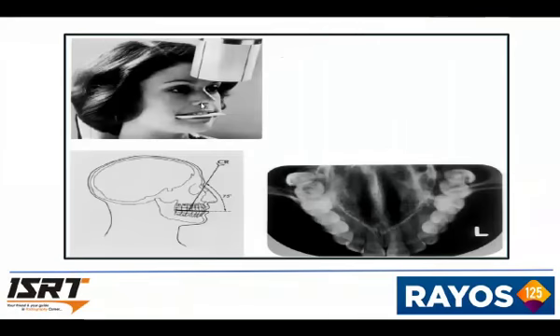So this is in the case of a mandibular occlusal. In the maxillary occlusal, we could see the whole of the palate in relation to the teeth. So that can be evaluated in the case of cysts and extension of the cyst, etc. So this is the case of a true occlusal. We need a dedicated X-ray film for the occlusal, and we are directing the beam caudad or cephalad in the case of maxillary and mandibular.